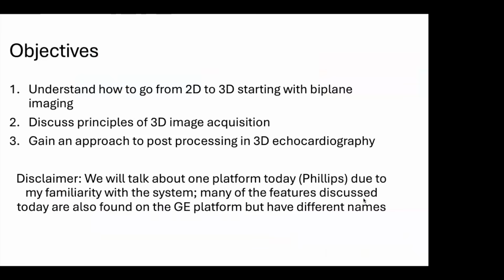So these are the objectives for today's talk: to understand how to go from 2D to 3D. We're going to spend some time talking about biplane imaging, and then we're going to talk about image acquisition and then image processing for 3D echocardiography.